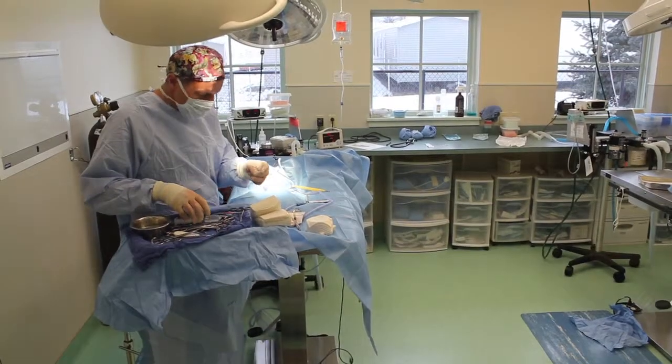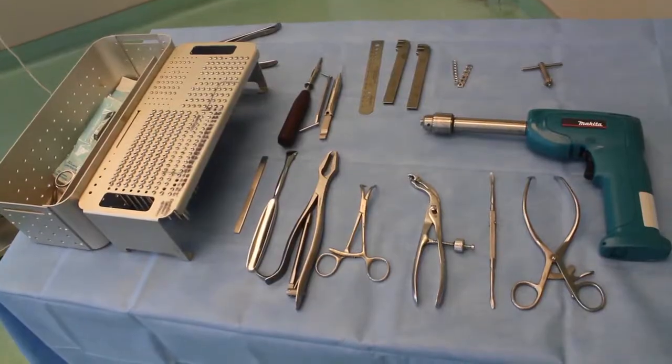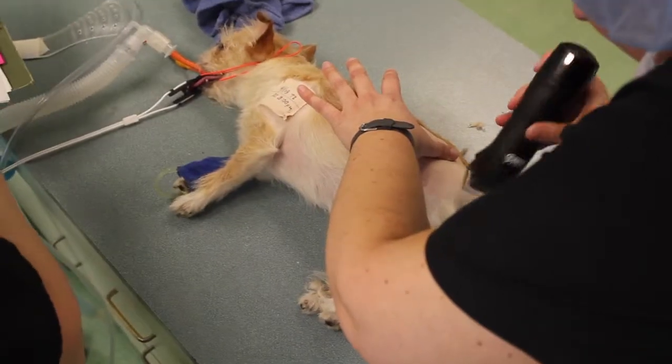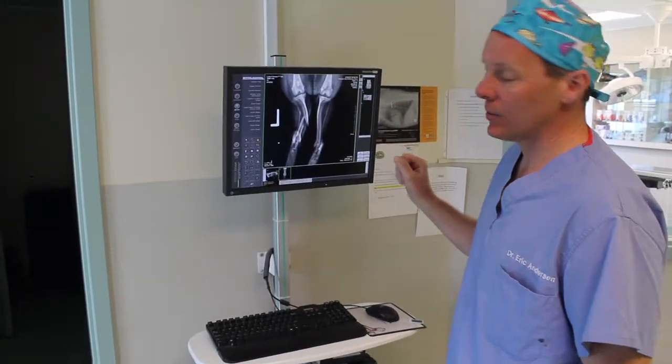Bone plating requires a surgeon with advanced training, a good deal of special instrumentation, a well-trained staff, and a very clean, sterile surgical unit. Surgical preparation is very important for a good outcome.